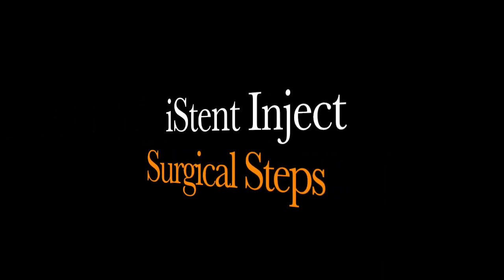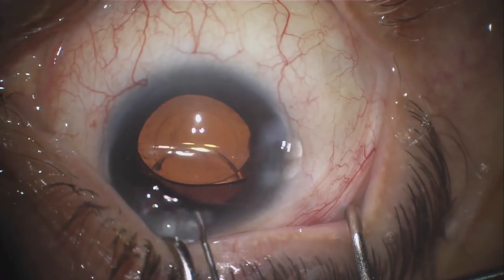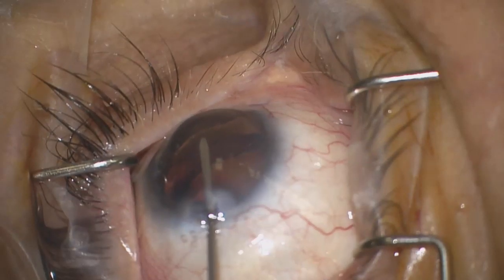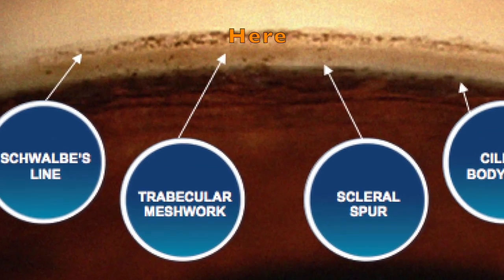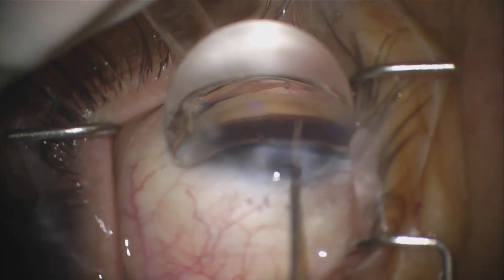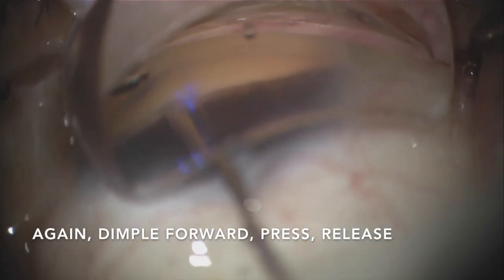Let's talk about the surgical steps. After completing cataract surgery, fill the anterior chamber with viscoelastic to pressurize the anterior chamber. Next, introduce the inserter into the anterior chamber across the pupil nasally through a clear corneal temporal cataract incision. Then retract the sleeve to reveal the trocar, which is placed at the center of the trabecular meshwork. Then place the gonioprism on the surface of the eye after placing copious viscoelastic to gain an excellent angle view. Take the inserter tip and place it right at the center of the trabecular meshwork. Press forward, dimpling the trabecular meshwork, release the first stent by pressing the delivery button, then pull the inserter back leaving the stent secured in the trabecular meshwork. Then guide the inserter two to three clock hours away from the first stent and repeat the insertion step. Then you're done.